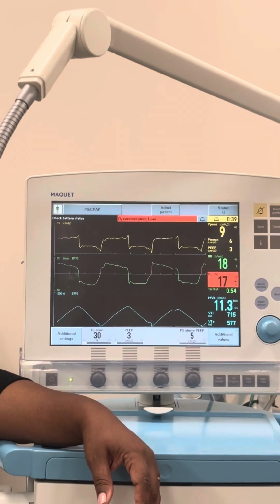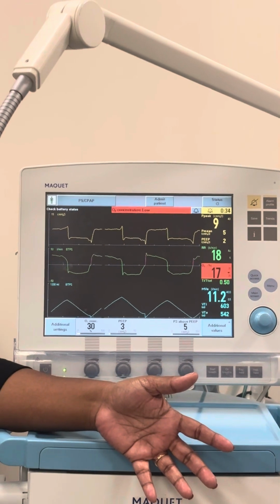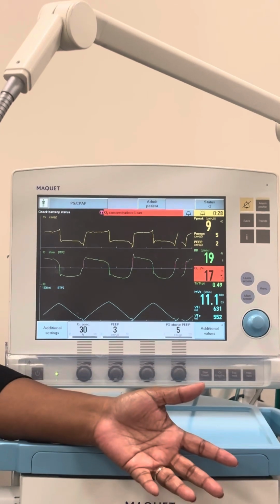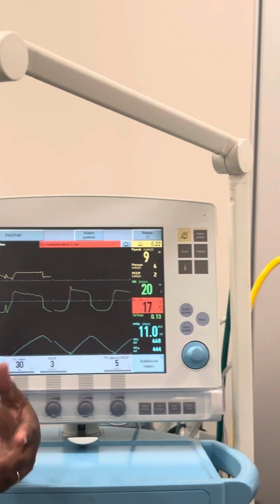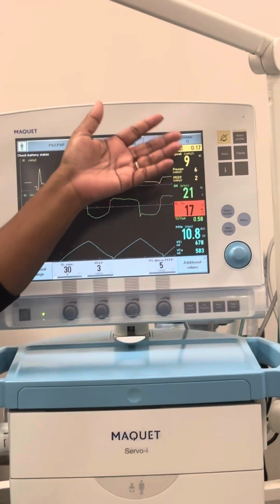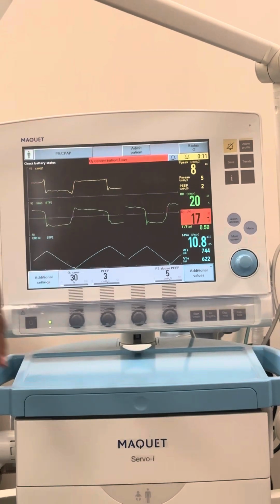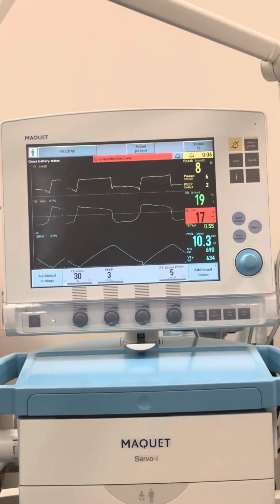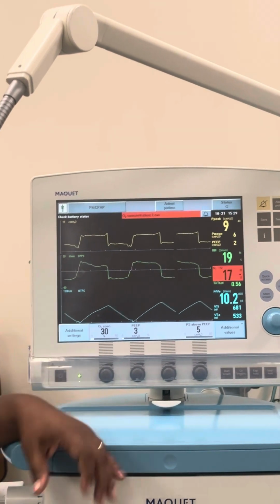Once everything looks good after spontaneous, got your spontaneous tidal volumes at least what? What should your spontaneous tidal volume be? 3. That you should be measuring. 3. So over 300, so 300 to 350 on spontaneous volumes. Your respiratory rate is normal range. You've got your vital capacity, you've got your MIP, you've got your RSBI, you have your PIP, your FiO2's low, your secretions are minimal, your sedations are low, there's no paralytics. I mean, all that, the list goes on, right? So once everything looks good, your patient's not diaphoretic or doesn't have any work of breathing problems, low pressure support, low PEEP, I can go and extubate. Right?